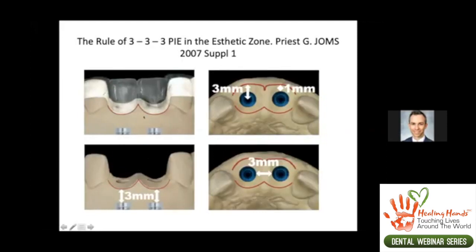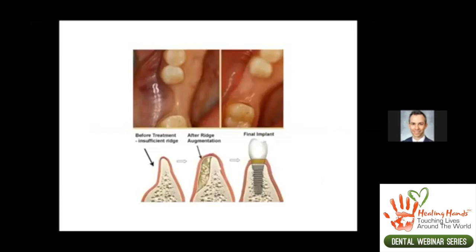So keeping all that in mind, when you're thinking about placing your implant, even if the bone may be thin in some areas, more crestally, look to see maybe you have enough bone where the implant needs to be, and maybe you could graft and place the implant at the same time. If not, if I'm on the fence, or if there isn't enough, I like to be more conservative and try to do a separate bone graft first to make sure that the implants are going to be in great bone.